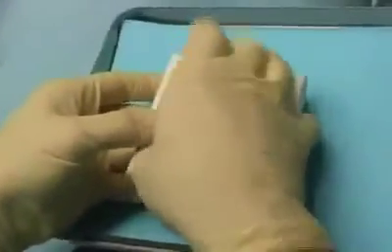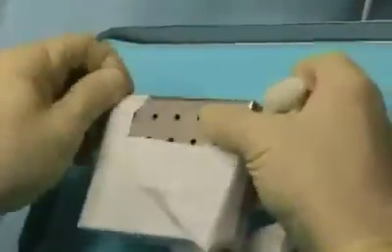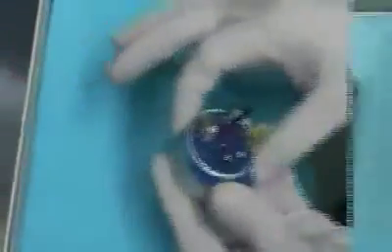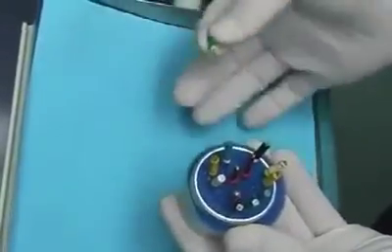Furthermore, it's very important to work with sterile instruments. Here you see a root canal treatment box wrapped to preserve its sterility. It's open just prior to the root canal treatment. The various instruments are neatly arranged. However, in far too many cases, root canal work is performed with unsterile instruments. Instruments are placed openly in simple foam rubber racks, as seen in the image here.